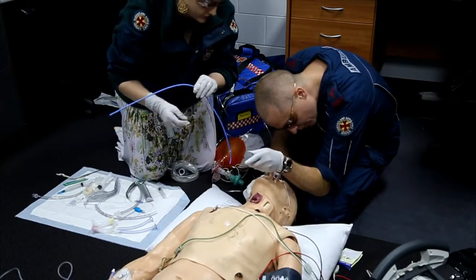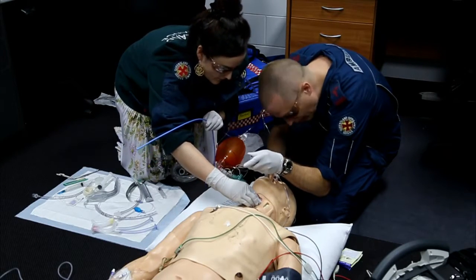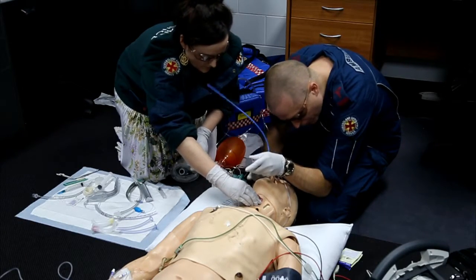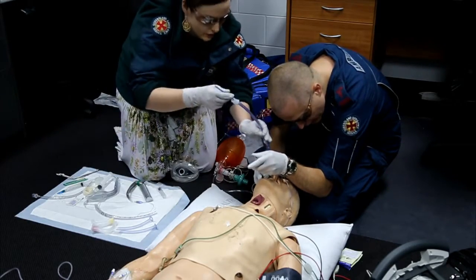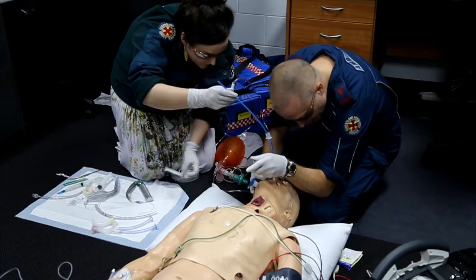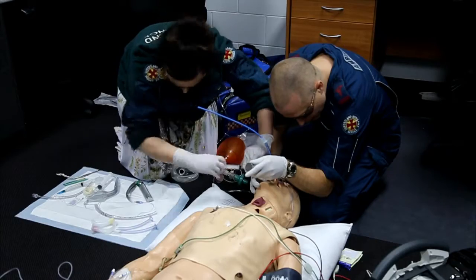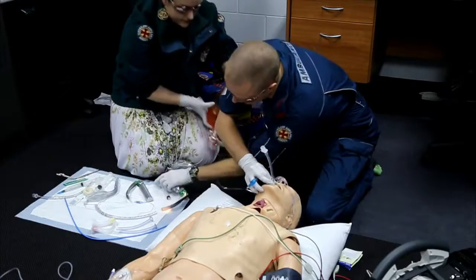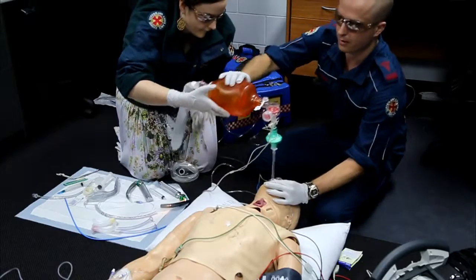Okay. Again grade 3. Can you provide some laryngeal manipulation? Thank you. Doesn't improve. Okay, that hasn't improved, so again, we're going in blind. Can I get you to railroad the size 7 tube? Got the bougie. Okay. Thank you, inflate. Cuff inflated. Remove the bougie. Thank you. Okay.